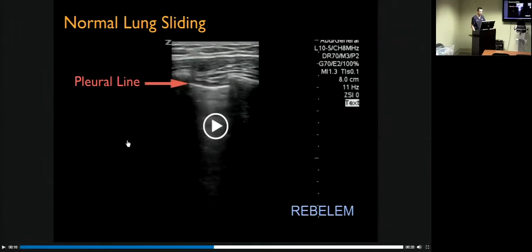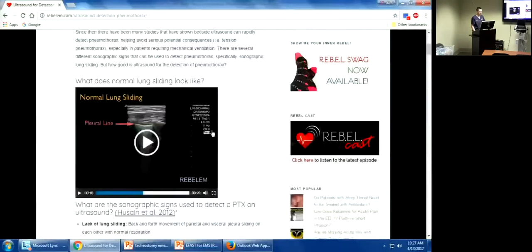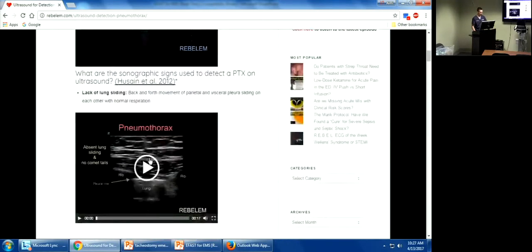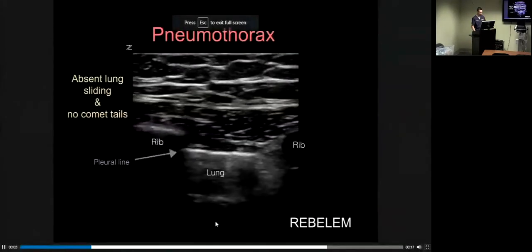What's the sensitivity of that as far as diagnostic ability with pneumothorax? What's the sensitivity of ultrasound of the lung? I think it's like 96 to 98. No, it's greater than X-ray. I don't know the exact number. It's much better than X-ray.